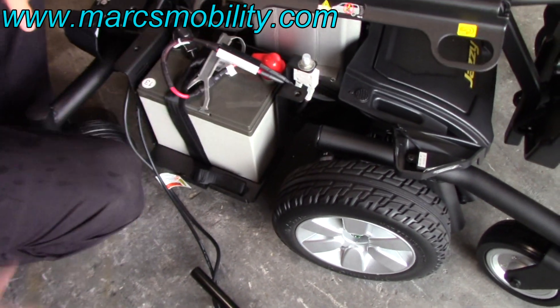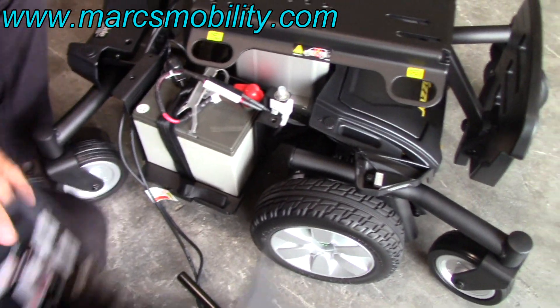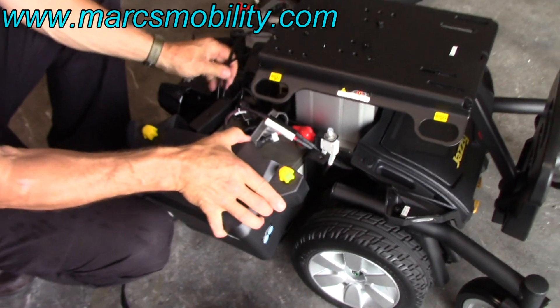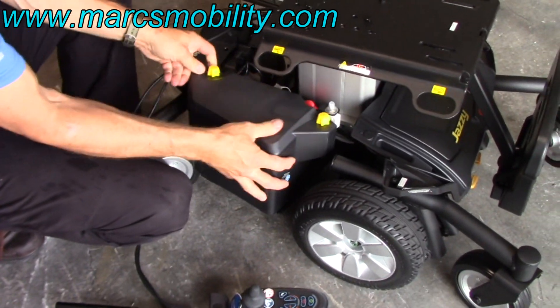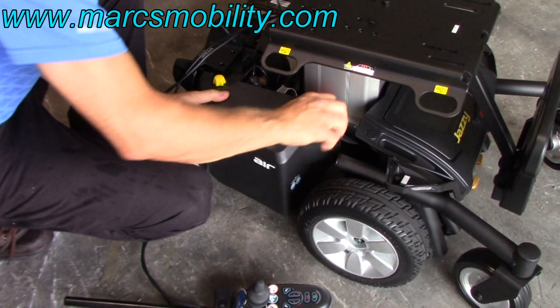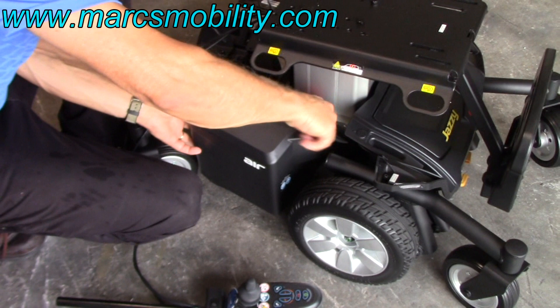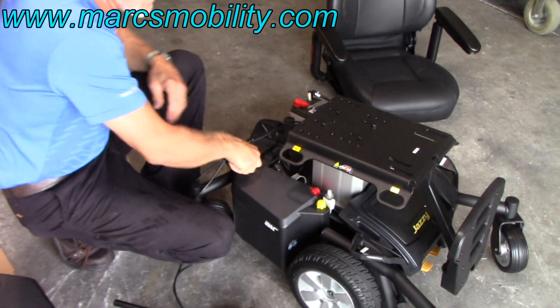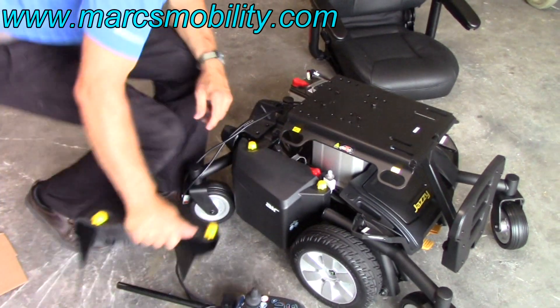That goes there, and then take your cover. This is your joystick. Put your cover right over the battery casing and turn the yellow knob until it's tight. Now you've got one battery casing on.